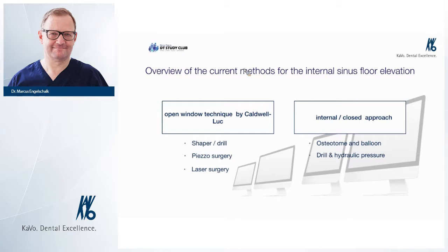So here we see the need for the implants, we see the need for the augmentation, and we can see on the patient's right side the septum. And this is also very important. If you try to drill an implant through a septum, I think you should be before or behind the septum, but never drill into a septum, because it's quite cortical bone, and it's very, very hard.